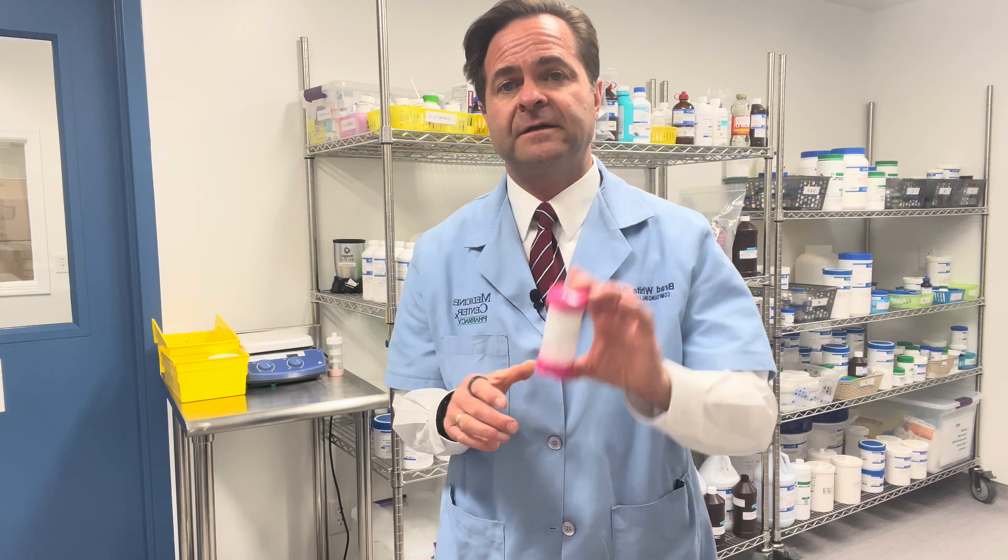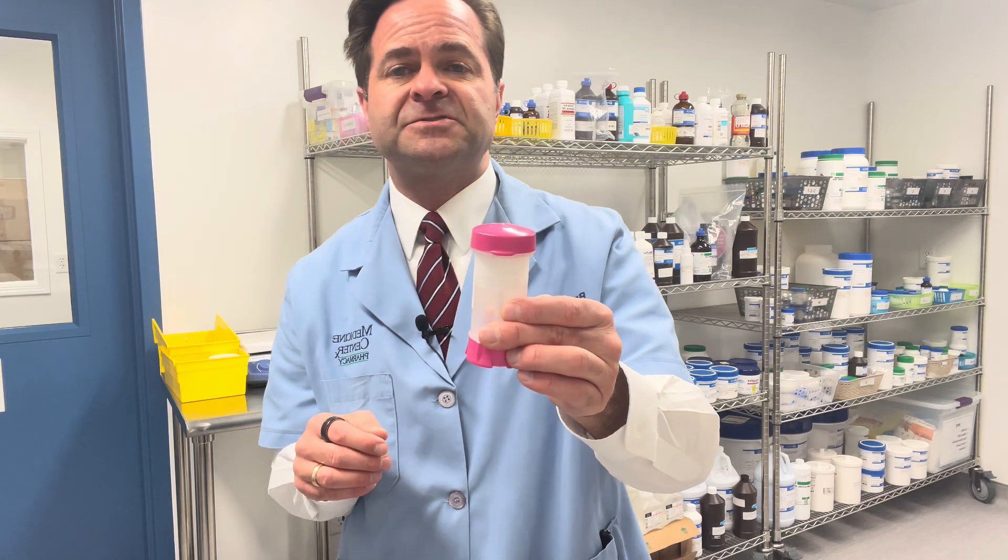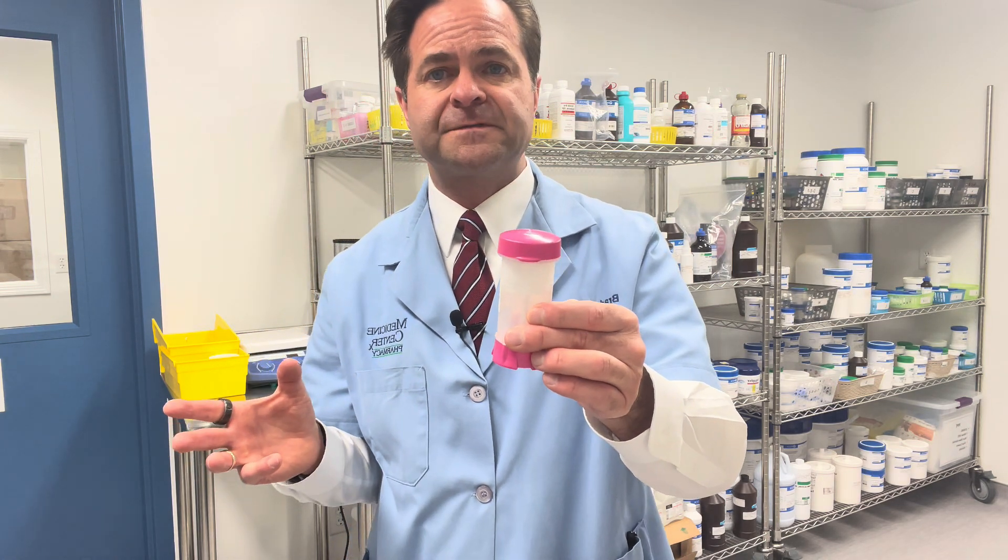I'm pharmacist Brad White from the Medicine Center Pharmacy, and I'm coming to you today in our compounding lab. I want to talk about a device we use to dispense our creams in. This device is called a TopiClick device, and it is generally used for different hormone therapies for men or women.